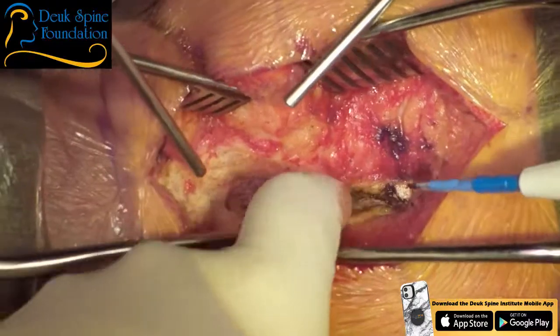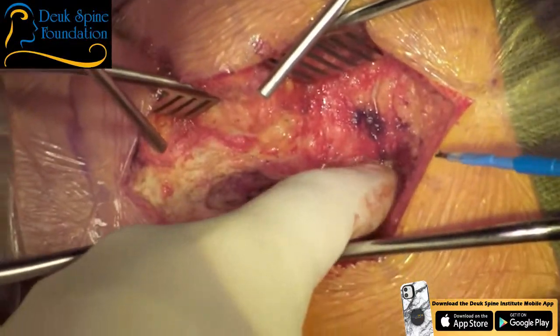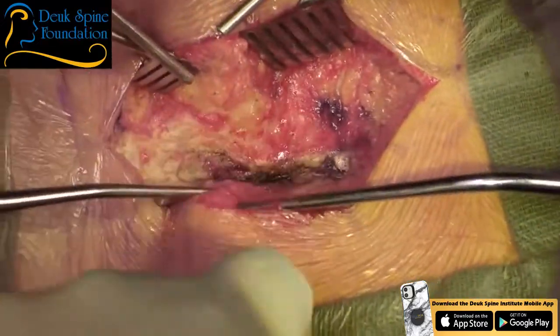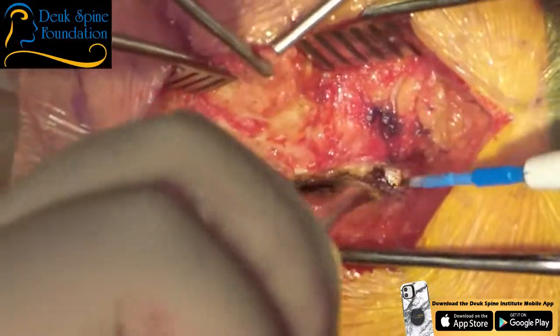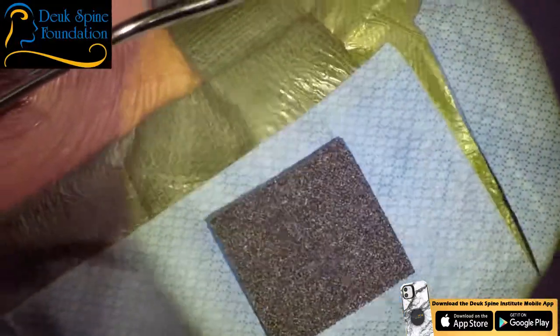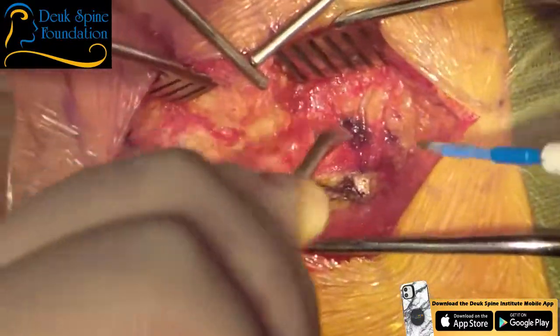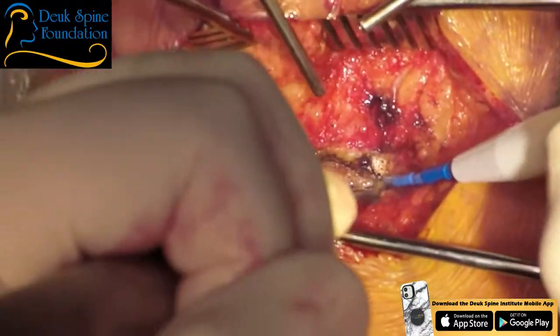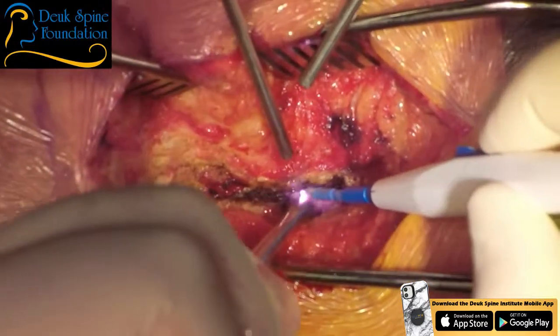So right now we're trying to get down to the spine so we could operate on it. And I'm feeling the back of the spine with my fingertips right now, okay? So the first part of the surgery is the exposure, getting down to the spine. I'm gonna bend my Bovie tip in a little bit at about 10 degrees just so I could peel the muscle off of the bone.